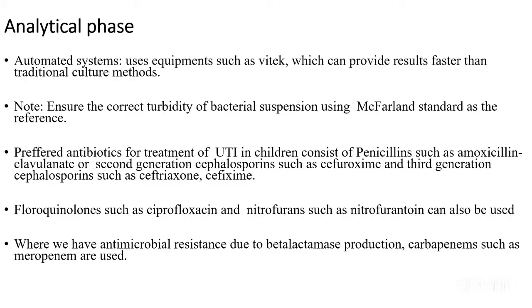This system will analyze the drugs using the minimum inhibitory concentration. This means the machine will do dilutions, and the minimum concentration of drug that can inhibit an organism is what the equipment will interpret as resistant or sensitive.